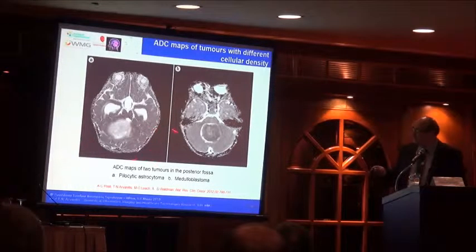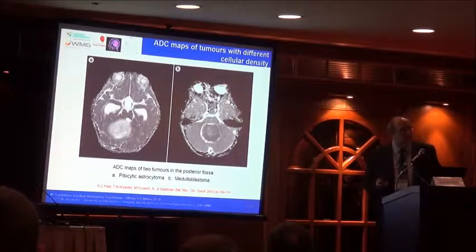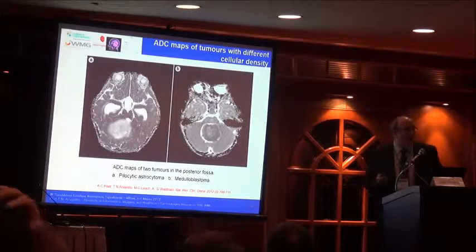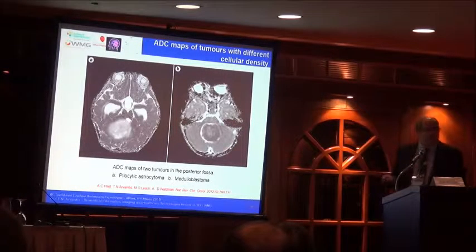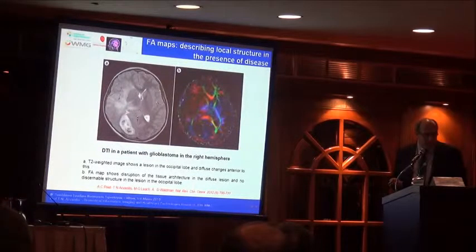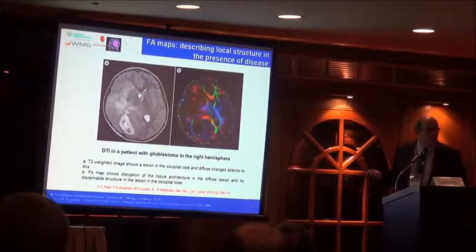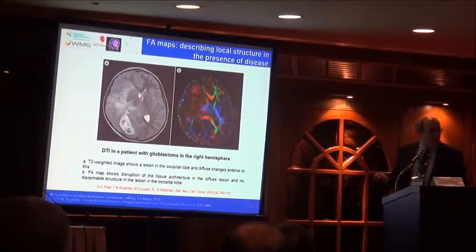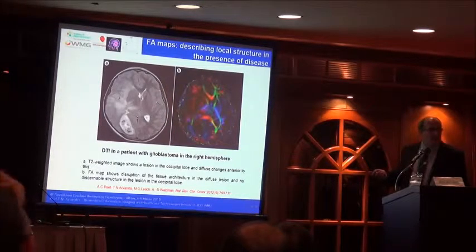So that information, of course, we see visually. Later on, we can see how we can use it in machine-based algorithms, based on data analysis, in making some decisions. Furthermore, we can use fractional anisotropy maps, part of tractography diffusion, to tell us a little bit about the structure and of the presence of the disease.